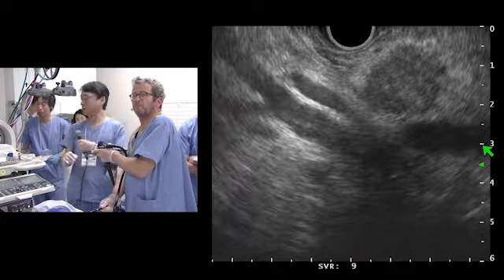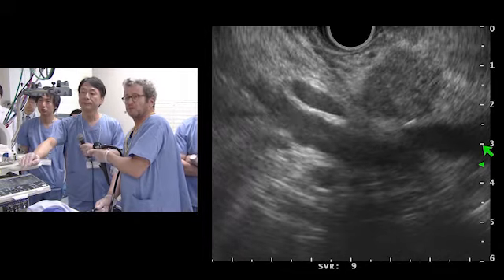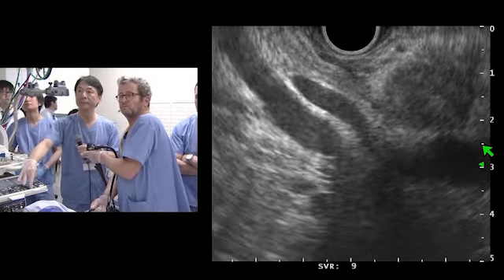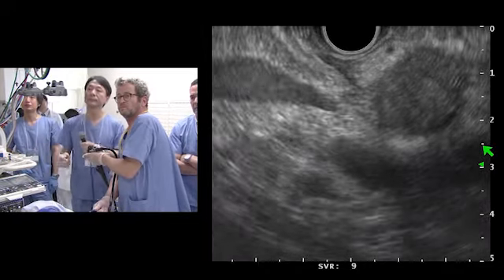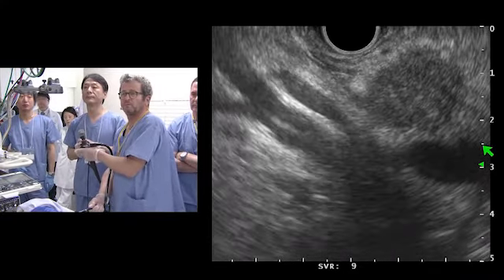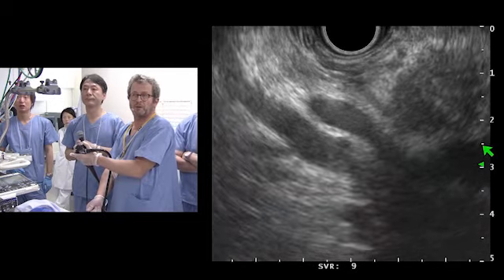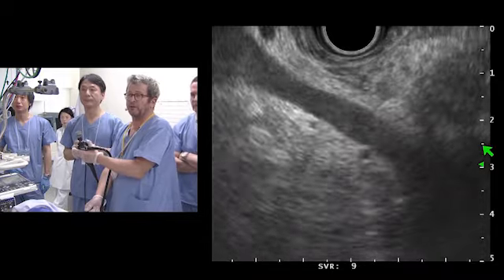Just a comment, we don't have fluoroscopic control, but the position of Thierry is a straight position. Yes. Because if you have a long position when you examine the pancreas, you are in trouble when you have to pass the FNA needle, which will change the flexibility of the endoscope. The straight position is definitively the best one to position the tumor in front of the endoscope, except that I'm obliged to have a bending up here. So when I insert the needle, I need to be like this, and then I will turn like this.